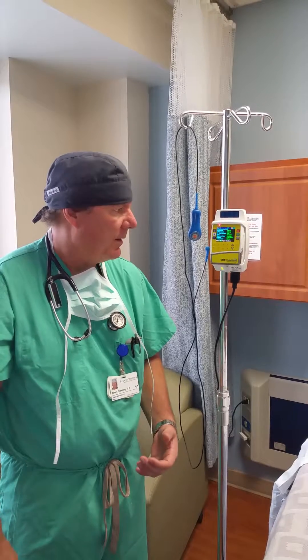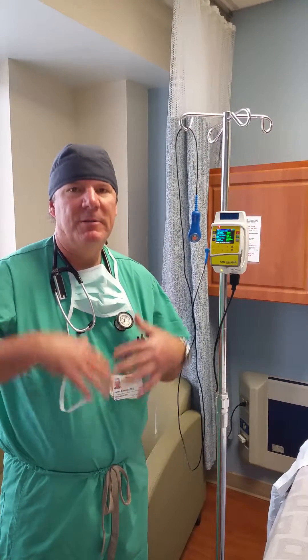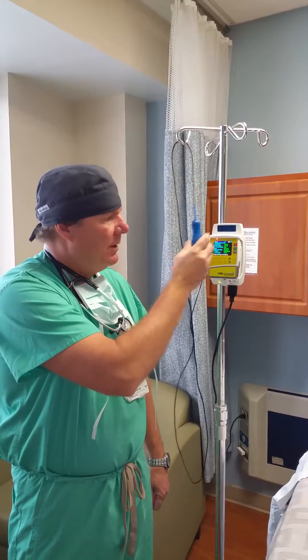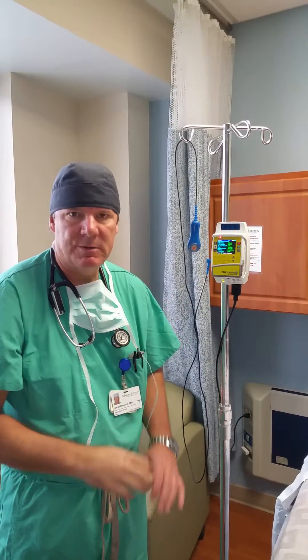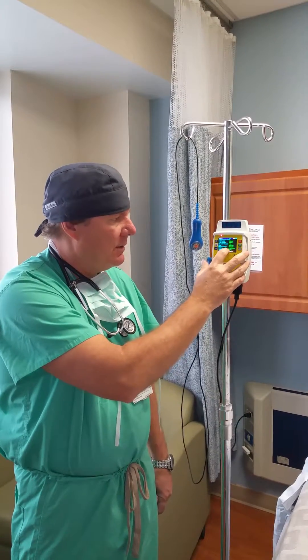Every 30 minutes they can hit the button and give themselves an extra 5cc. That 5cc is enough to feel, but not enough to bring the level up to where you're numb and can't breathe. So they can't abuse it. If they hit the button before the lockout time of 30 minutes, it just doesn't give them the extra bolus — it gives that 5cc 30 minutes to work.